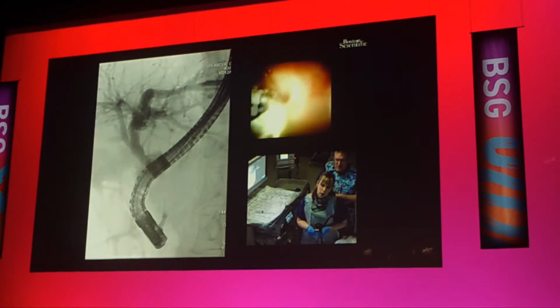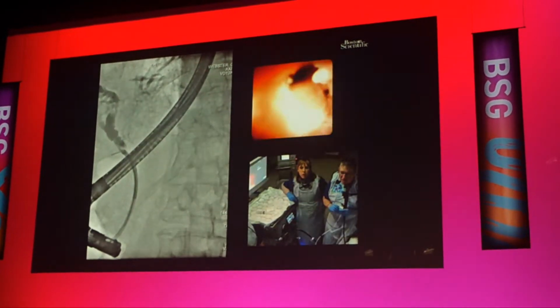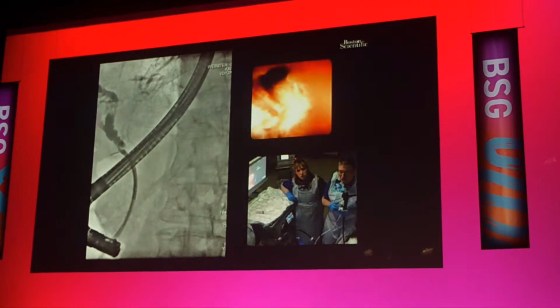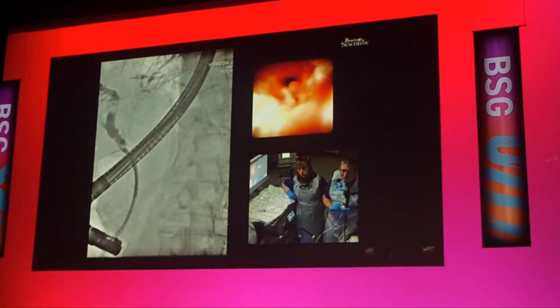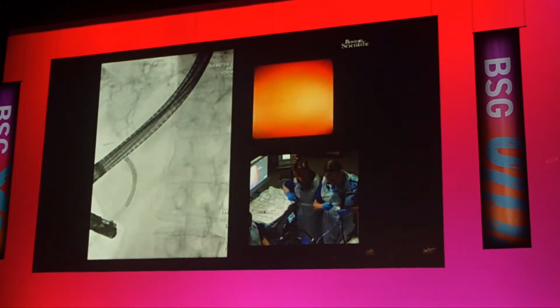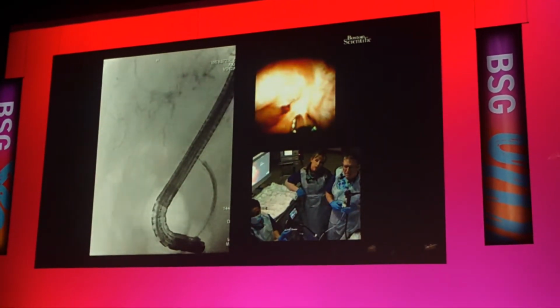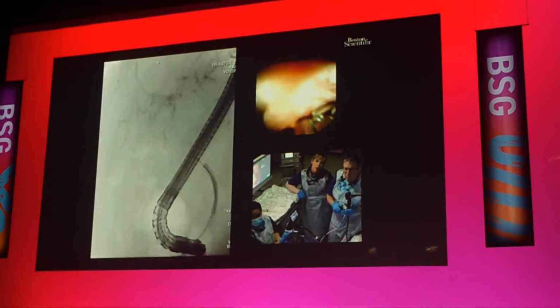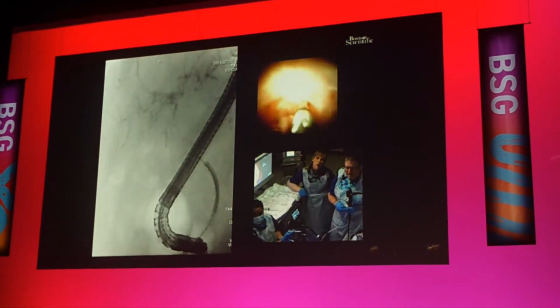And as we go in with the cholangioscope, we come across a mid-CBD stricture with abnormal friable mucosa, although there are no features that are characteristic of malignancy. Tissue is the issue, so we go on and do cholangioscopically directed biopsies. It's also important to note we're able to get the cholangioscope above the stricture and see that there were no stones above the stricture or below, so this is an indeterminate stricture that we need to sample. You can see the biopsies happening there.